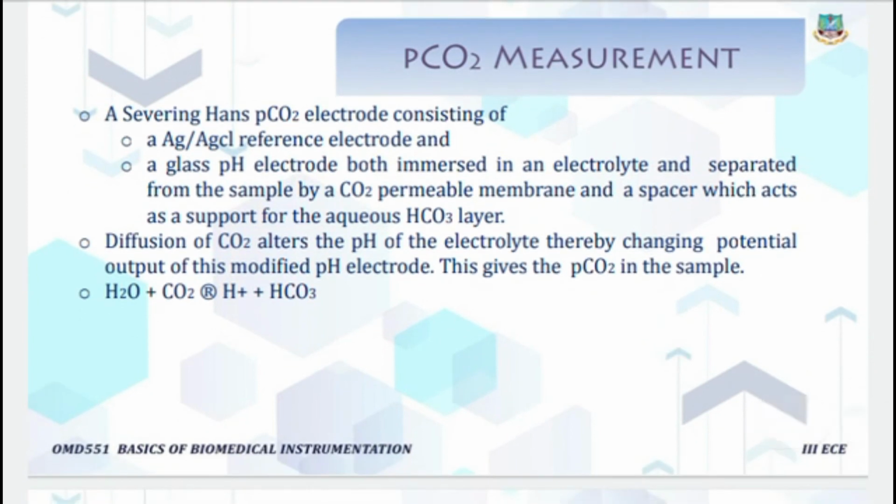So in this blood gas analyzer we are measuring the pH value, PCO2 value, and PO2 value. Okay, hope you all understand.